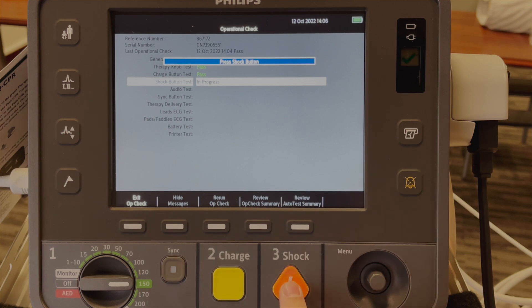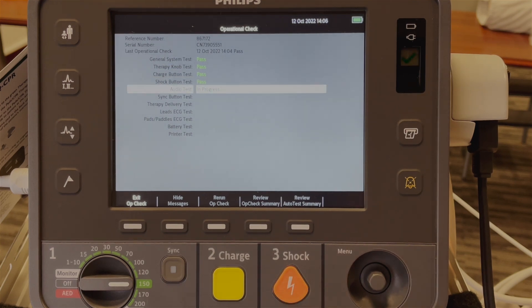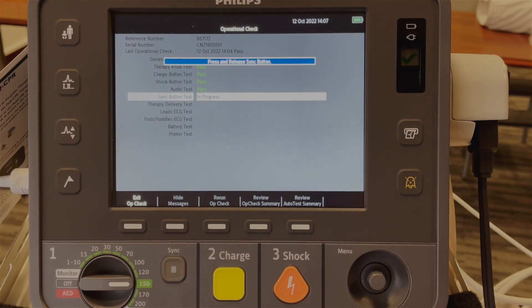Press the shock button. Shock delivered. Did you hear 'shock delivered'? Yes. Press the sync button and release.